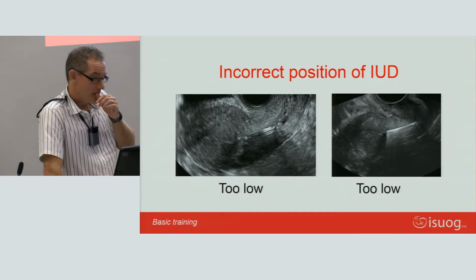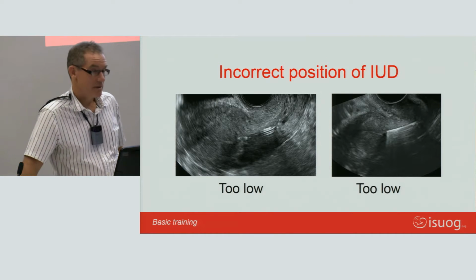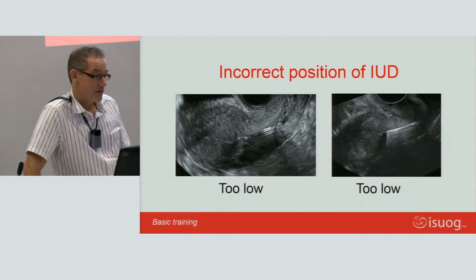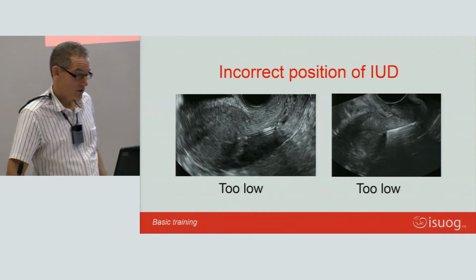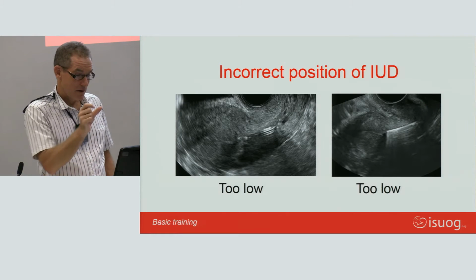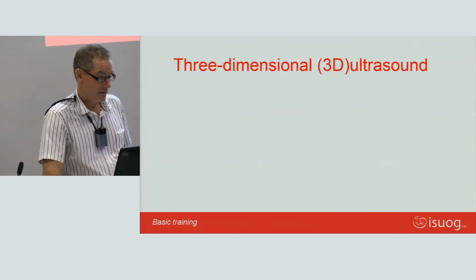Okay, so sometimes there's a fad at the moment, especially at Groote Schuur and Mowbray, where they're putting in devices at the time of cesarean section, and obviously then you've got a big uterus. And then we get to see them 2 or 3 months later, where the uterus is involuted. And it's amazing the different shapes and positions that you can see with these IUCDs. These ones are quite easy to see if they're just low in the cavity, because you can follow up the IUCD, then obviously you can follow the rest of the fundus. And you can see that that's too low in the cavity.